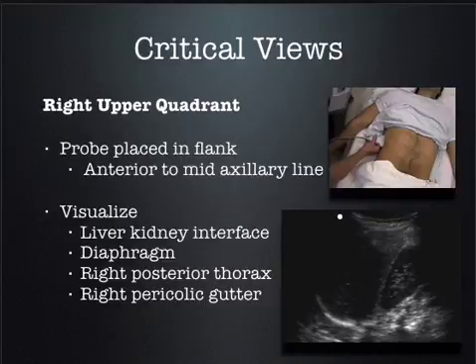So this is why fluid collects here and not below the kidney. The kidney is retroperitoneal, so intraperitoneal fluid cannot get behind the kidney. It collects above the kidney, between the kidney and the liver. Does that make sense? All right.